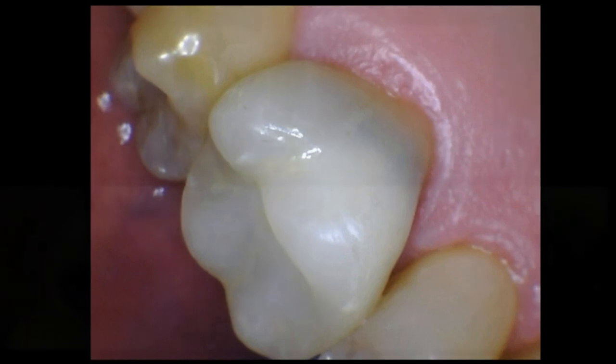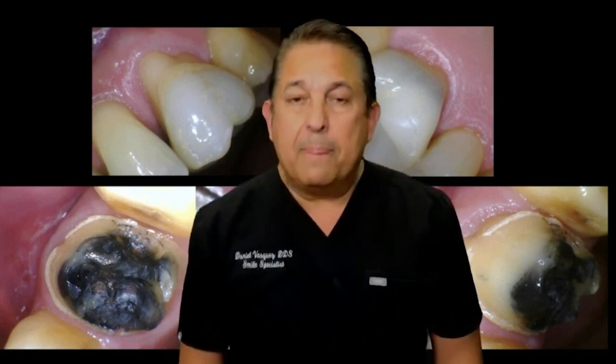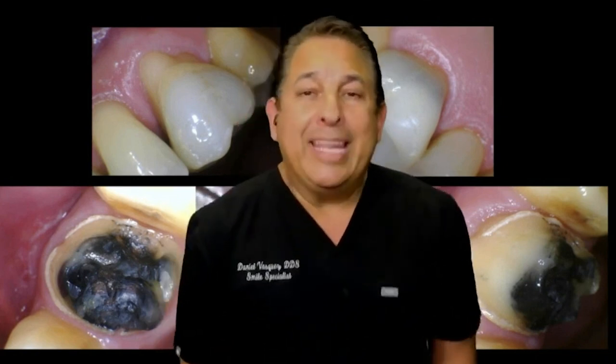So we have this patient who comes in, we remove the old restoration, and the patient has this amalgam, you know, all the dent and the stain from the old amalgam. You can see the margin. We're going to modify the prep. Why? Because today, let me put myself here in front of the screen so everybody can see me. Today we are in adhesive dentistry.